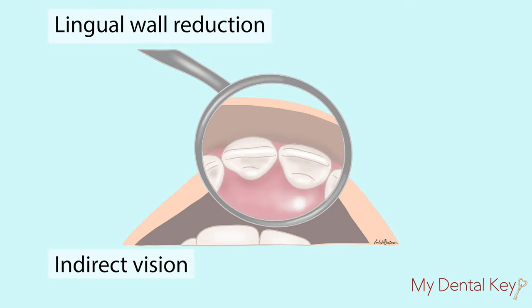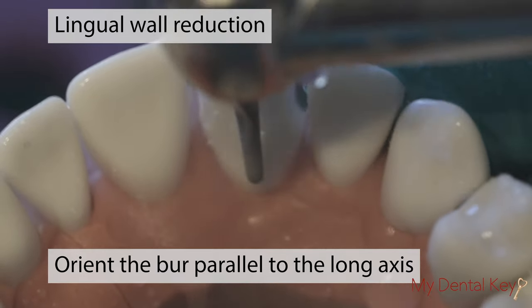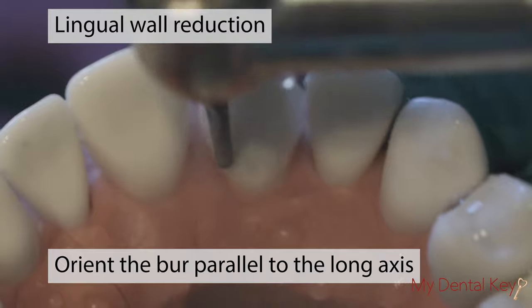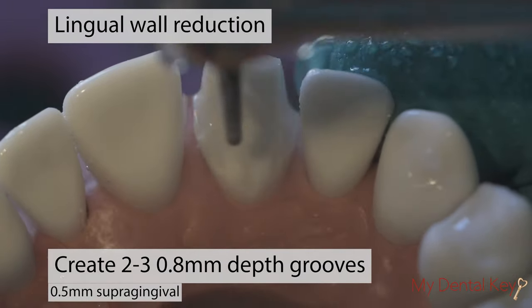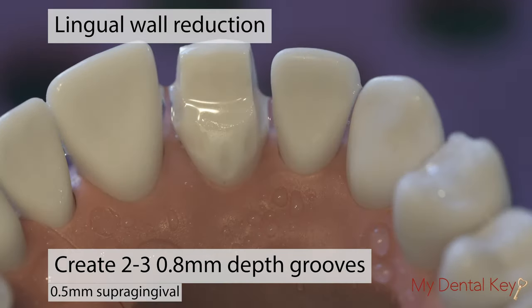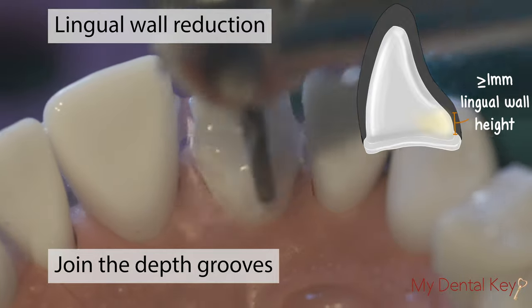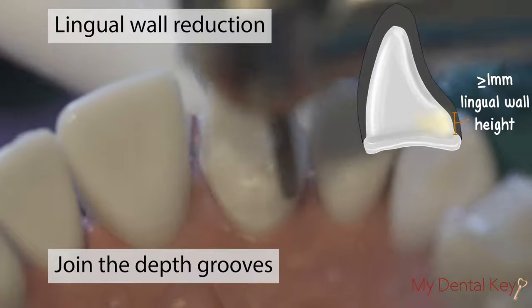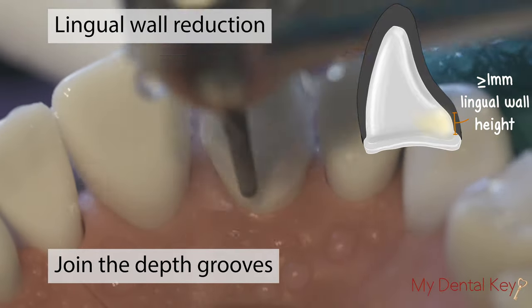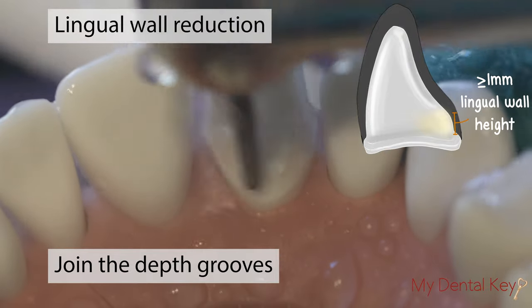For the lingual wall reduction, we will use indirect vision. Orient the burr parallel to the long axis of the tooth along the gingival third of the lingual surface. Optionally, create 0.8 millimeter depth grooves and keep them 0.5 millimeters supragingival. Join the depth grooves together. The final lingual reduction should be a uniform 1 millimeter, while height should be greater than or equal to 1 millimeter incisogingivally.